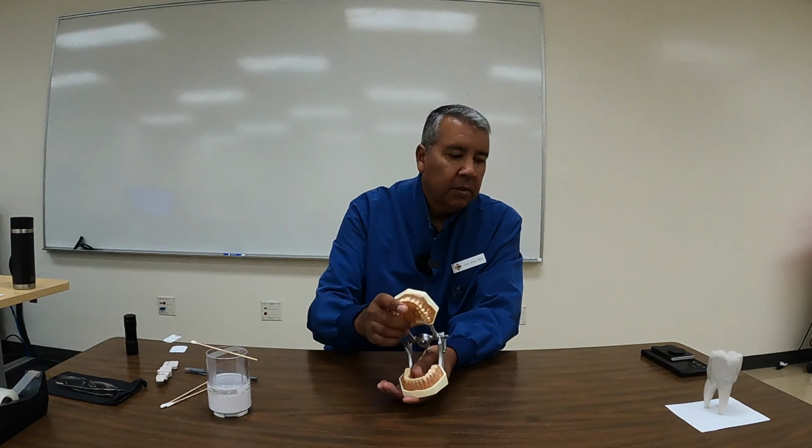So now we have to consider the vertical. Now I'm not talking about bitewings anymore. Now we're going to move on to something called the periapical. The periapical, P-E-R-I, apical, A-P-I-C-A-L, periapical. The prefix of that, peri, means around. Apical is referring to the apex.